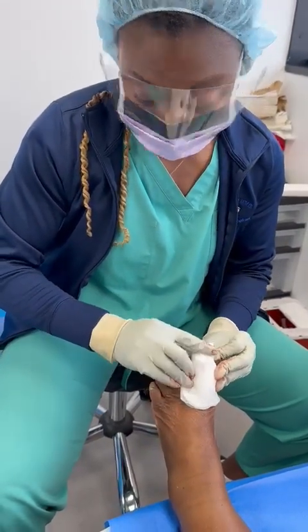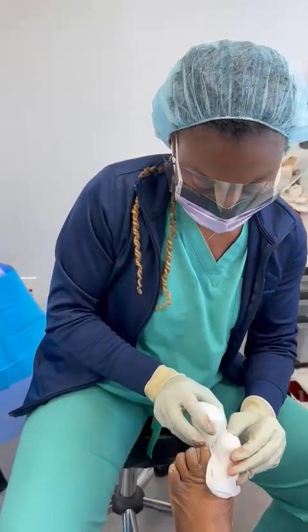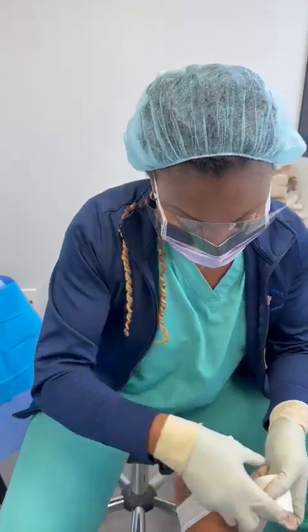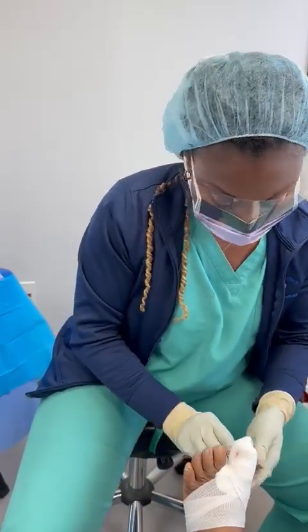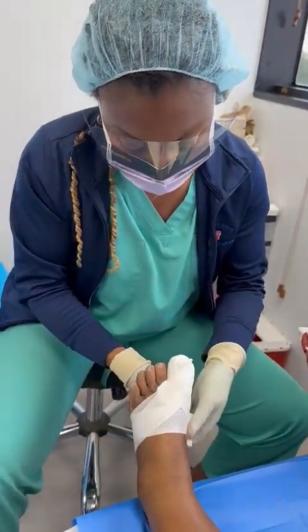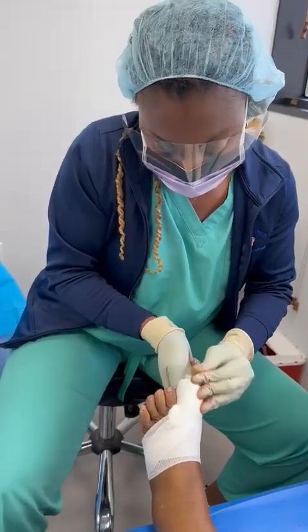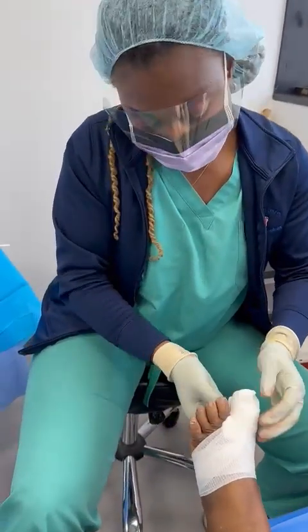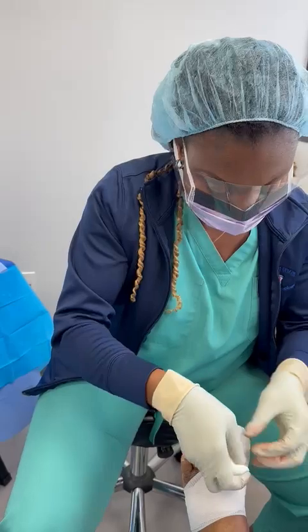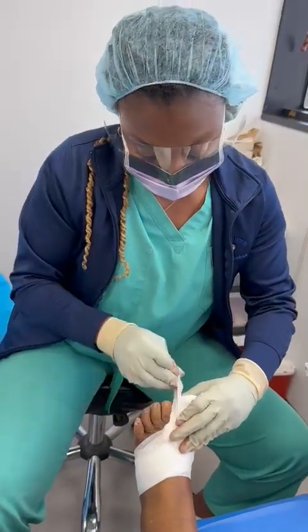So I really like to spend time really debriding that nail bed, which I think most podiatrists sometimes fail to do. If you want to have a really good outcome and reduce the chance of the nail coming back dystrophic and infected with fungus, which is our main concern, you really want to make sure you debride the nail bed pretty good, and then offer the patient a product, like I said, that is antifungal, antiviral, anti-scarring, and antimicrobial, which means that it will kill whatever bacteria on contact that is on the nail bed, and really increase your success.